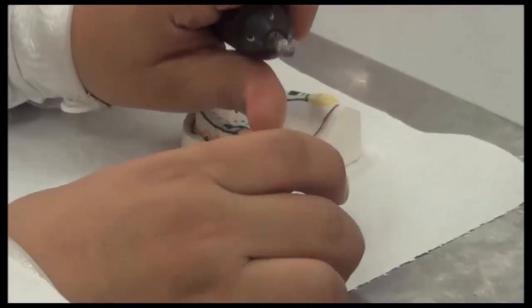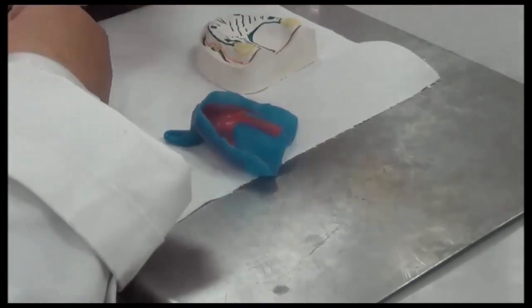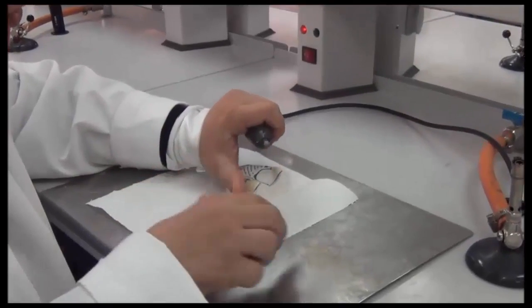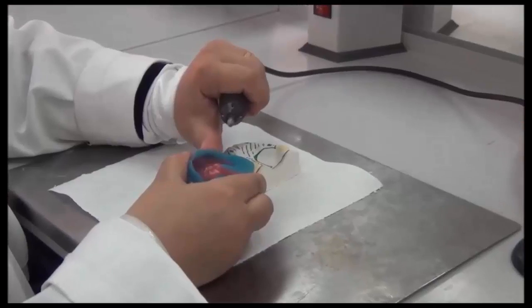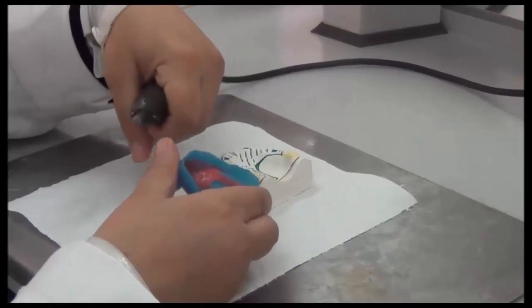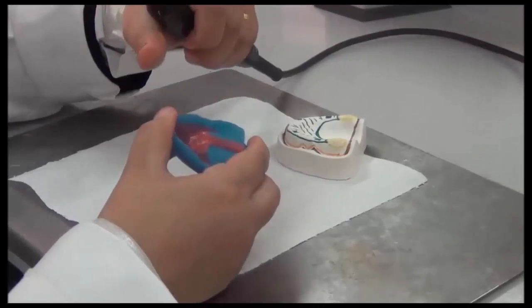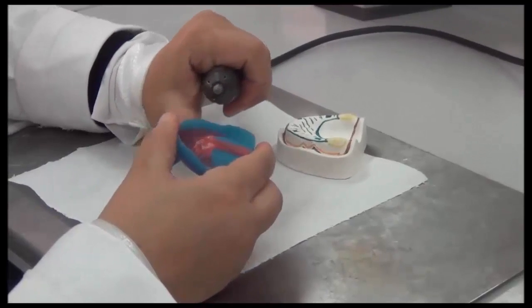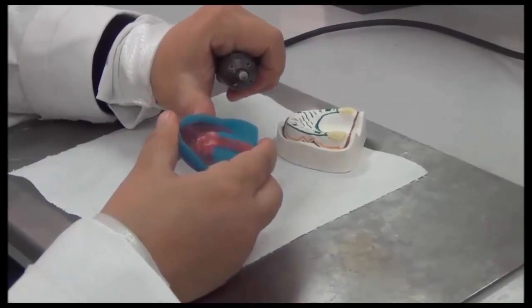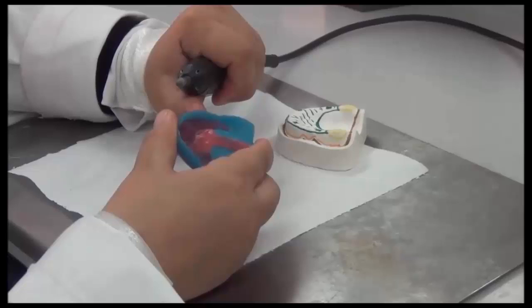I also want you to notice that I'm holding with what we call the safety grip. I hold the handpiece with 4 fingers, and I leave my thumb out to rest on the material that I'm trimming. If I don't have this hand rest, it might slip away and traumatize me, because it's not safe. Sometimes you're pressing so much and it simply slips away. So we need to make sure this slippage, if it occurs, is controlled. We put a finger rest here and we work. Even if this slips away, my finger is preventing further movement.